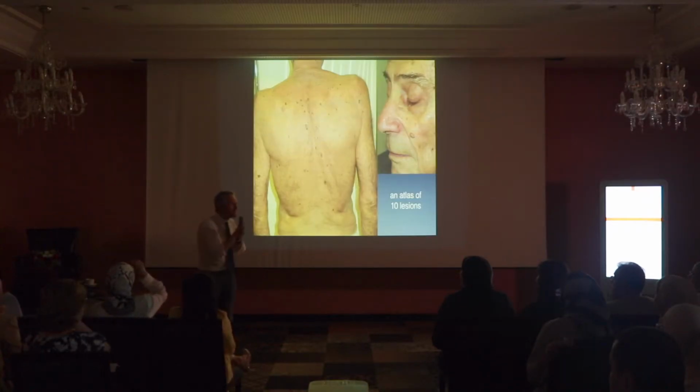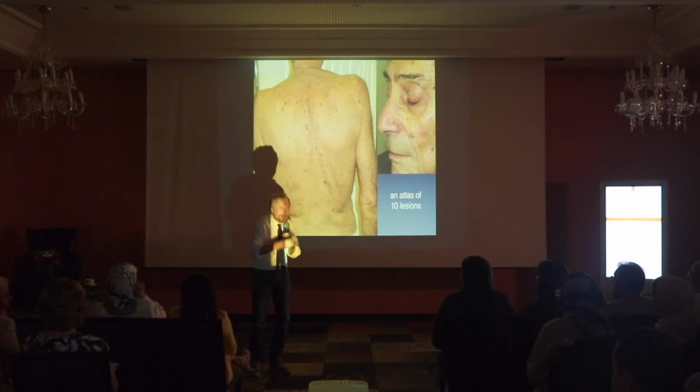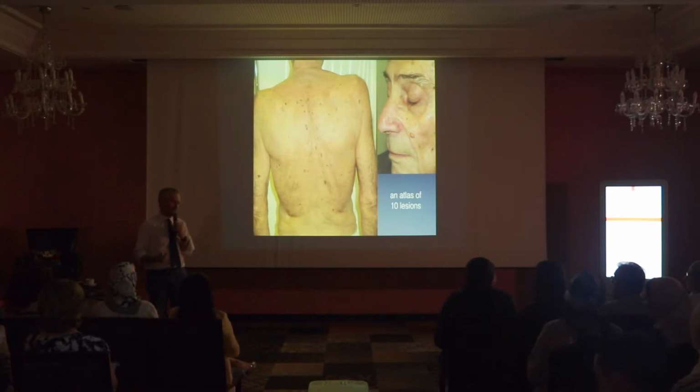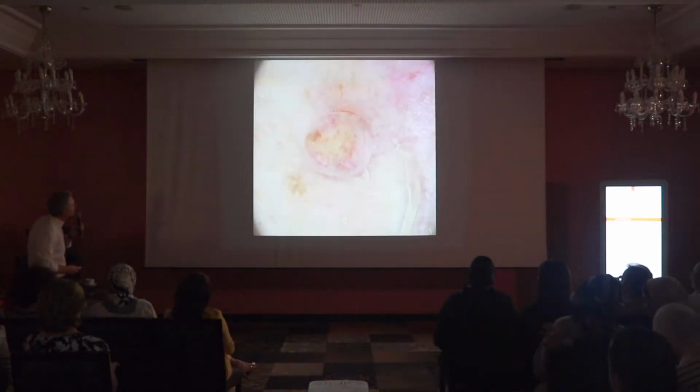You touch it, and it's soft. You can move it with your dermatoscope. This is the most important criterion. If I see a lesion which is soft, then it's a dermal nevus. If it's hard, I have to change my mind. Anyway, this is a dermal nevus also by morphology.